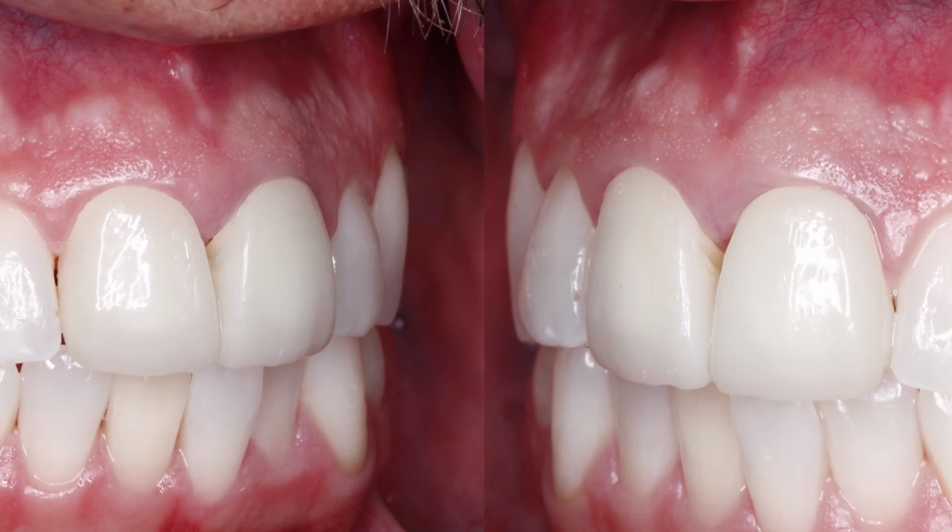Now for us, the next step is going to be to bring the patient back, and it is an extra step. What I want to do is have the tissue heal completely before capturing the final impression and having our final product. So I look forward to having you back here to view part 2 of this 2-part series for this case, for the material selection and progression of delivering final restorations for this case.